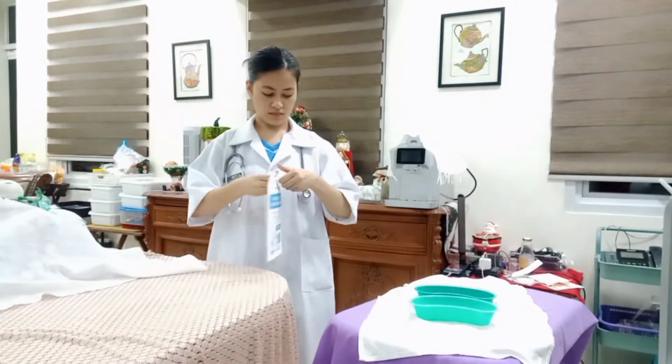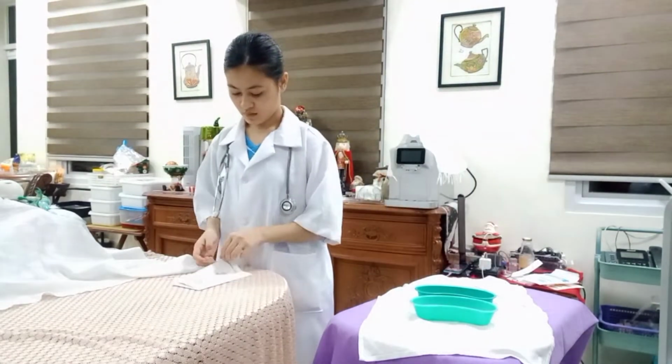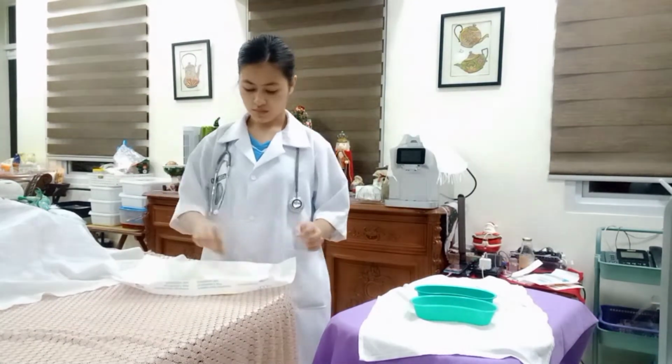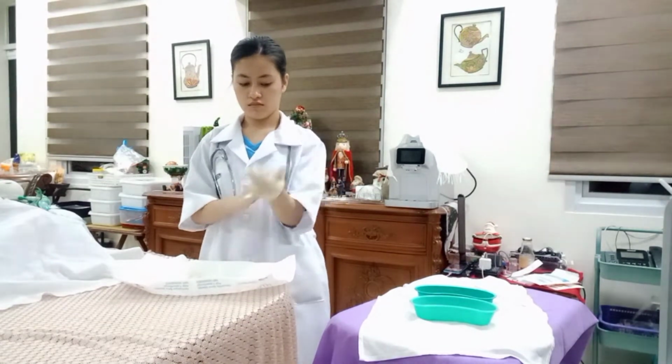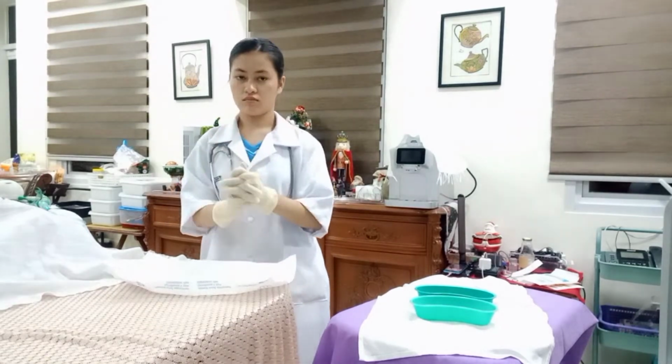So next is don sterile glove. So keep the glove on your dominant hand sterile. So handle the sterile supplies with your dominant hand only. For the rationale, this is to maintain aseptic technique of the procedure.